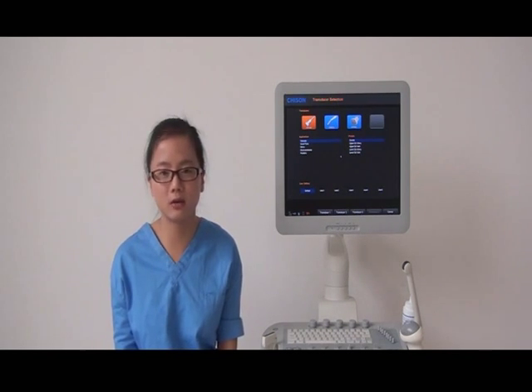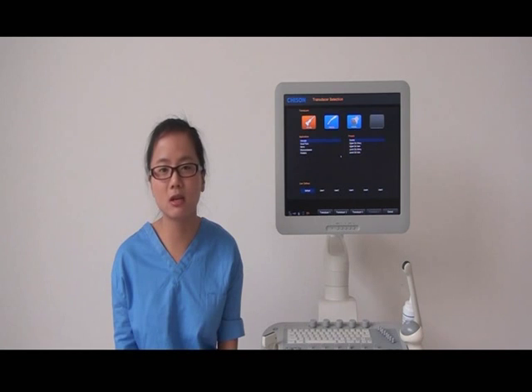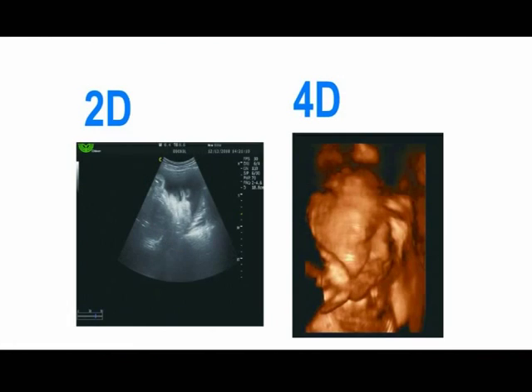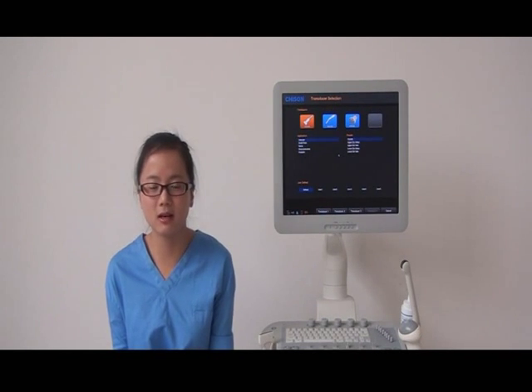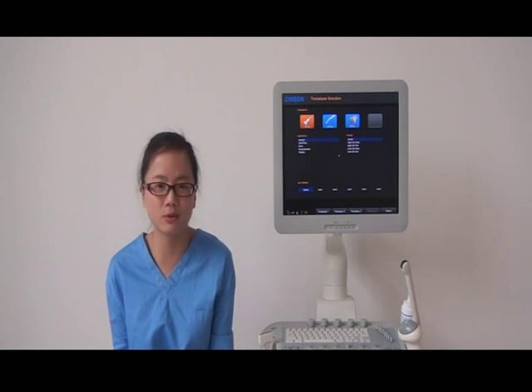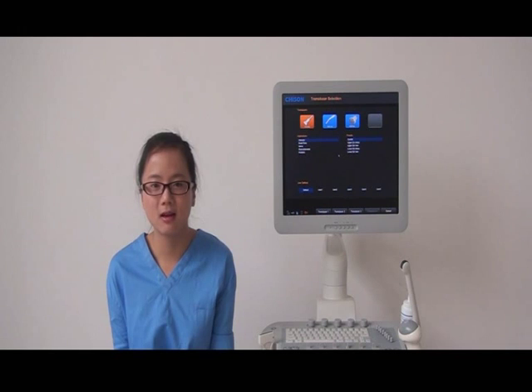4D ultrasound uses the same technology as the conventional 2D ultrasound that everybody is familiar with. It allows you to see the baby in three dimensions and see the movements taking place in the womb. Different from the 2D scanning, a successful 4D scanning is based on three key factors: gestational age should be around 6-7 months, fetus position should face outside, and there should be enough amniotic fluid.